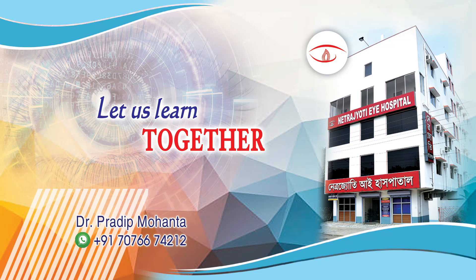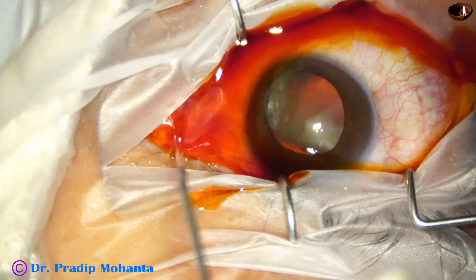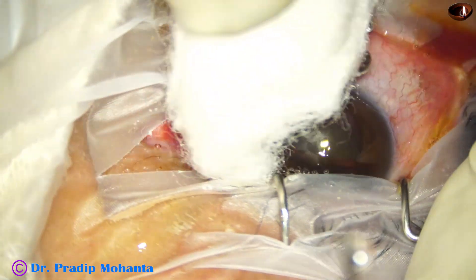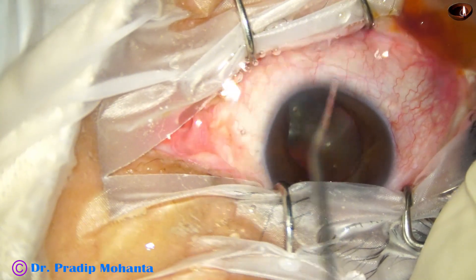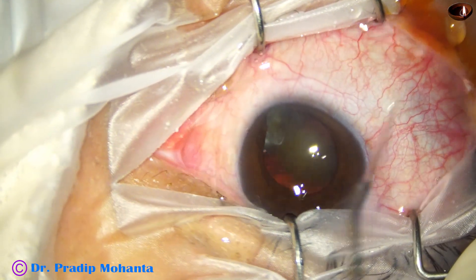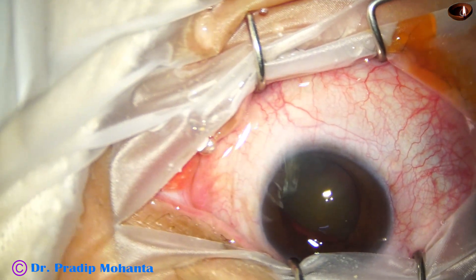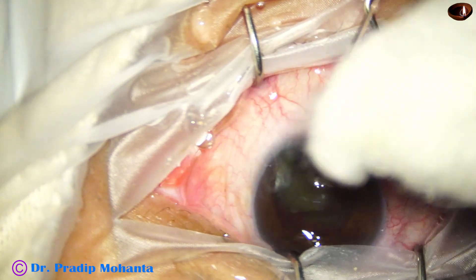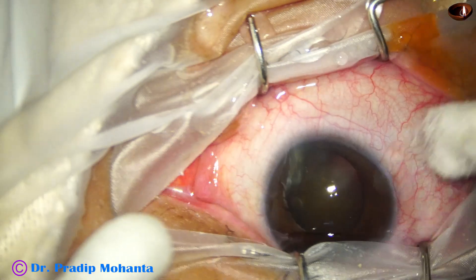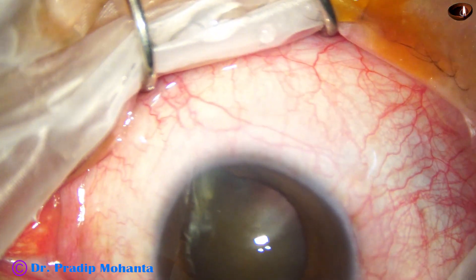Friends, welcome to my workplace at Ranakh Heart, West Bengal, India. This is a cataract with grade 5 nuclear sclerosis. There is coloboma iris and zonular defect for one clock hour at 5 o'clock. The eye is highly myopic and the calculated IOL power is only 4 diopter.